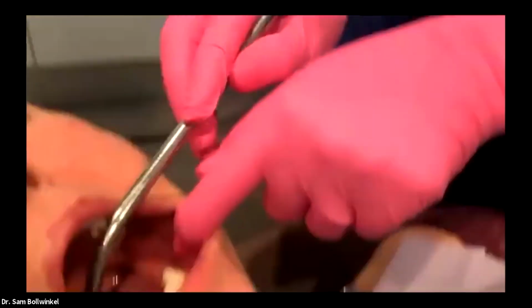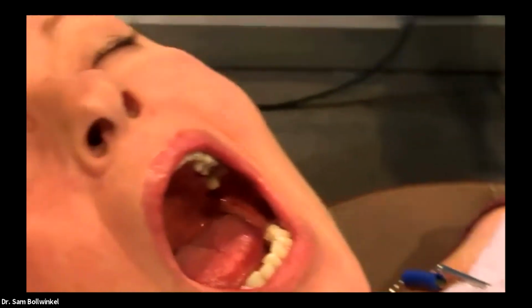It'd be interesting to show our participants. If you were doing freehand implantology, typically you're going to flap, do your implant, do some verification pins, and get your orientation. Go ahead and close, relax just a little bit there, Carrie. With this, because we already know and trust our system, we know that the guide is forcing us to put the implant right where we previously planned it. So quite literally, the verification has already been done virtually, so we can go right to the mouth and not take the time to do a bunch of X-rays to verify that piece.